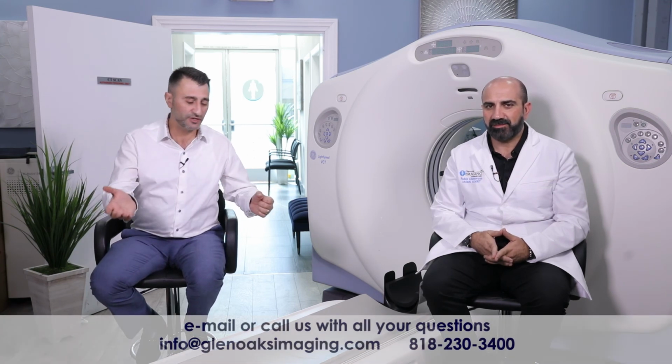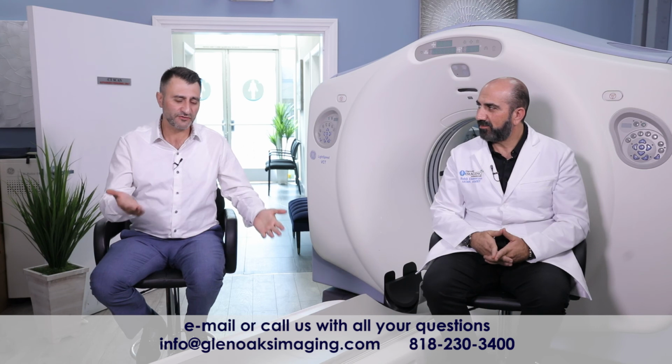One more thing I wanted to mention before, like Rubik said, situations. Not everyone can have an MRI. We'll cover MR safety in a later web series, definitely. There are people who have pacemakers who can't have an MRI. There are people who have aneurysm clips, they can't have MRIs, or have some kind of metal in their eyes. So CT is a great substitution. Yep, definitely. And also, since CT uses radiation, X-rays, the referring doctors will consider the patient's age as well, to make sure that if MR will be better, they save the patient radiation. It all depends on risk versus reward.